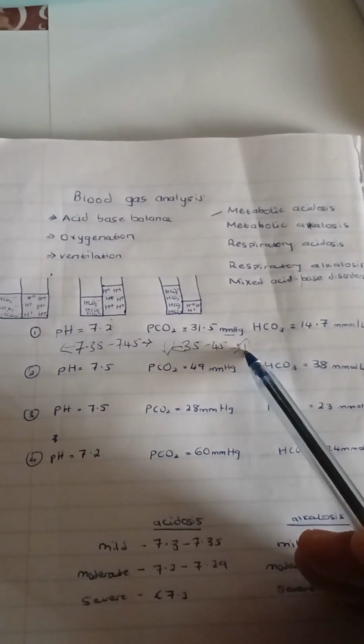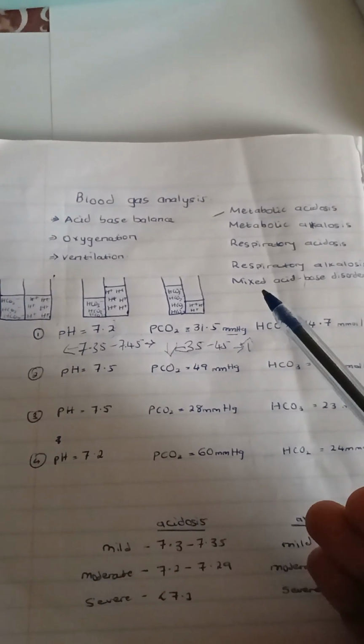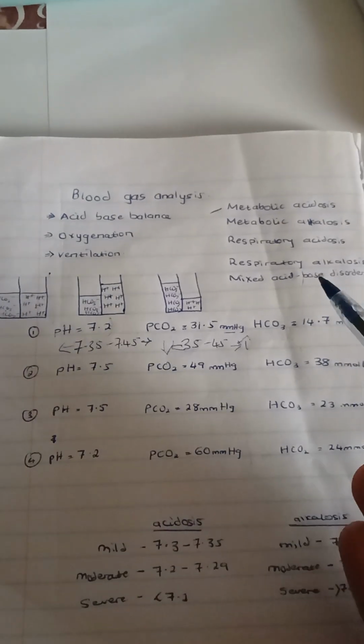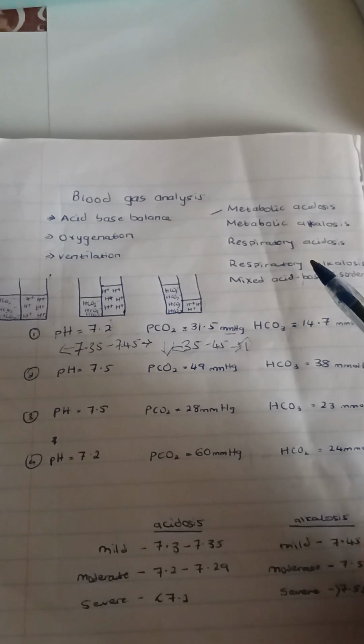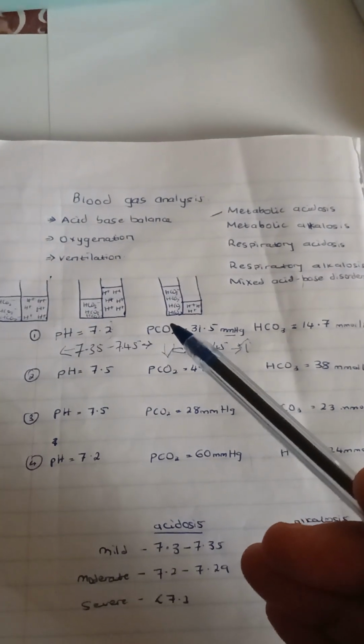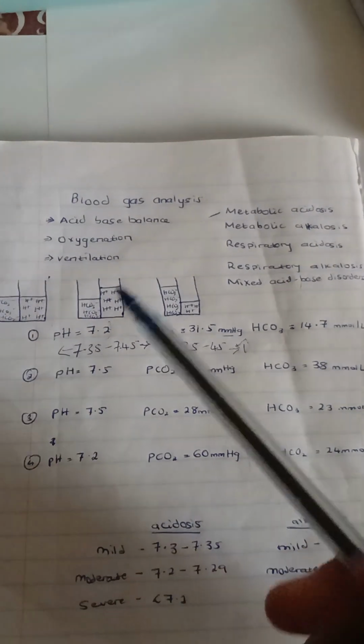Similarly, if the PCO2 is above normal, there are two possibilities. Either it's the primary problem, that is, it's causing an acidosis, or it's the compensation. It means the patient has an alkalosis and the body is trying to compensate by increasing PCO2.